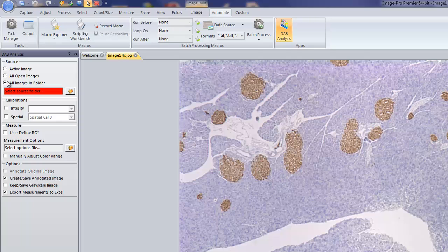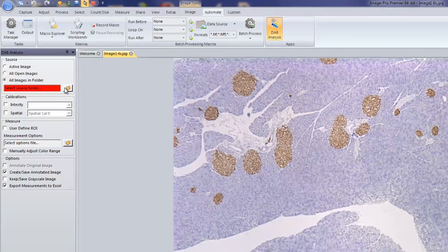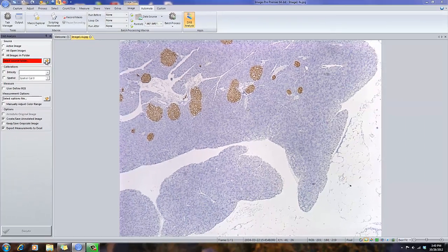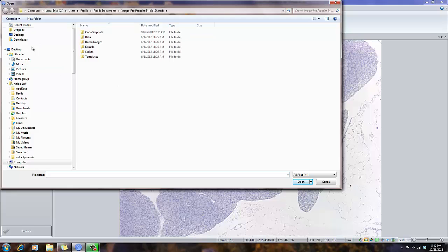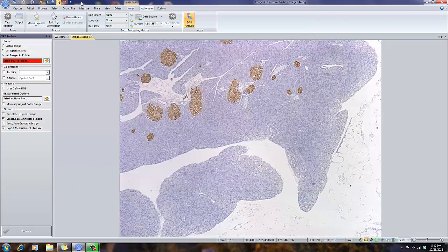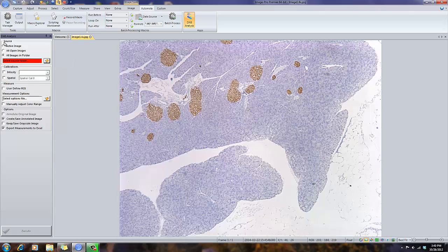And I can also select a directory of images by simply browsing to a specified folder and selecting those images. So in essence, I'll be doing a batch process. For purposes of this movie, I'm going to select the active image.